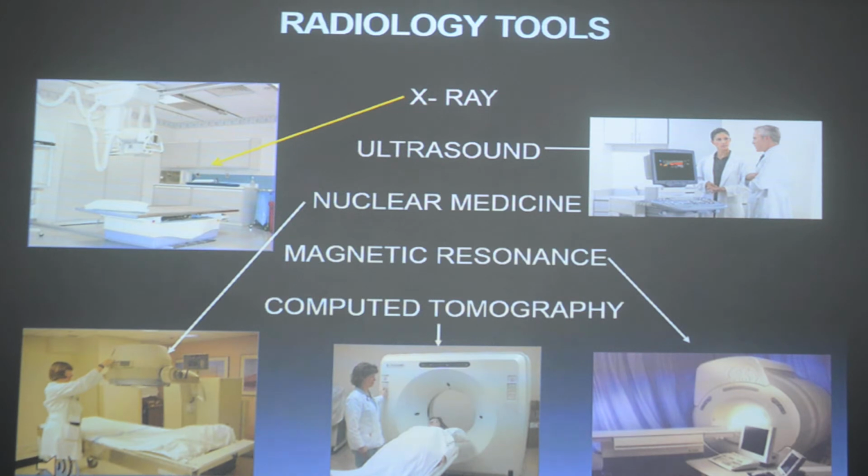The imaging modalities that by far the majority of cases rely on are the MR and the CT. Now, we have to differentiate between CT and MR. Which one do you think is the more important one in an ER setting? CT. Why? It's faster. Good. One answer is faster. And then what is the other reason? It visualizes strokes better. He's right.